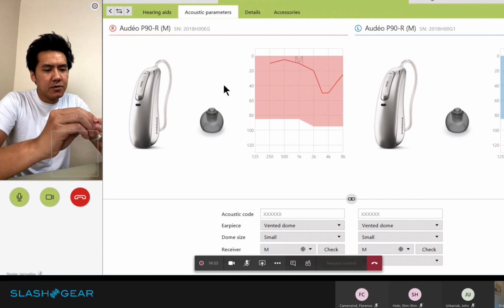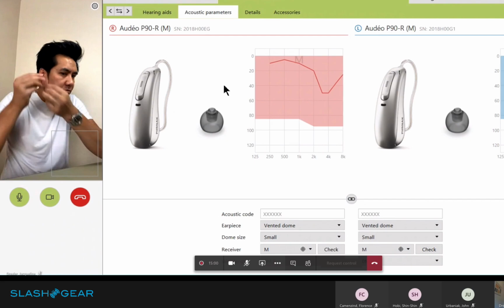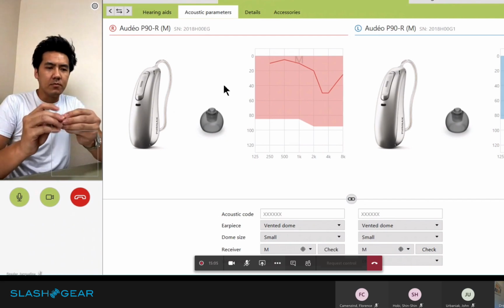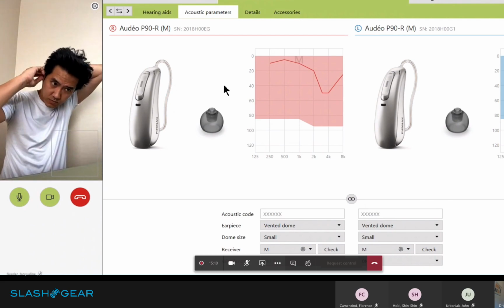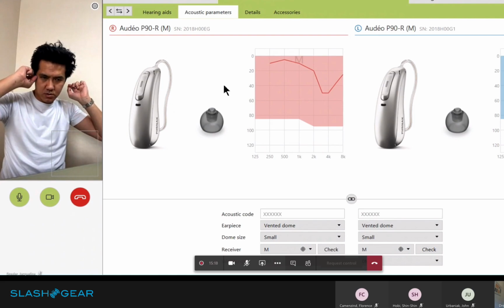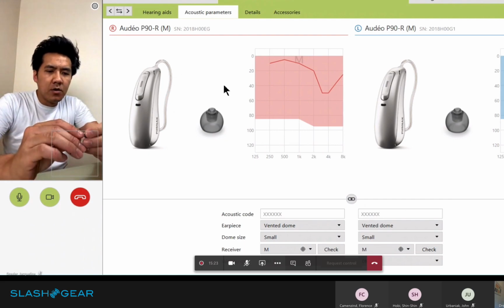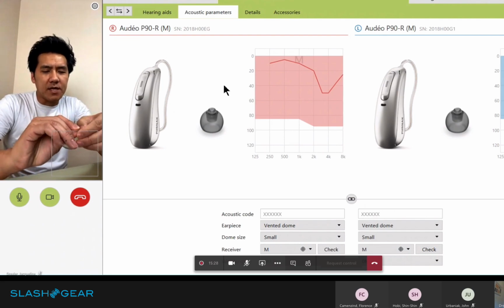Yeah, so they come in various sizes, and one of the benefits of being able to see someone in the clinic is to make sure we have the correct earpiece on. That is for the purpose of comfort, and also when we start off with this pre-calculation of our fitting, the initial fitting, to make sure we have the correct size that is comfortable and the correct venting. Because this will set up the stage for the sound quality for the client. That's what I was thinking. I kind of knew that was going to be the case.